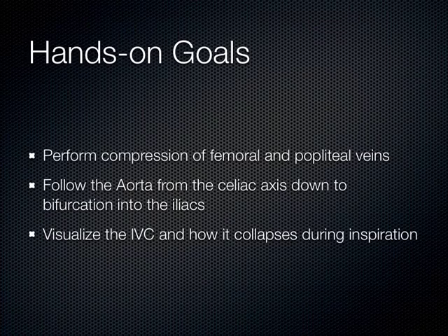Okay. So today, with the hands-on session, we're going to do compression of the femoral vein and the popliteal vein. Okay? You'll see how fast this goes today. It's going to be a pretty quick scanning session, I think, because you're just compressing the fem area, and then you go down to the pop, and then you're going to follow the aorta down until it bifurcates, and then I want you to look at the IVC and how it collapses during inspiration. That's about it. If you want to move on, ask other questions, you have time left in your group, by all means, scan whatever you want today.